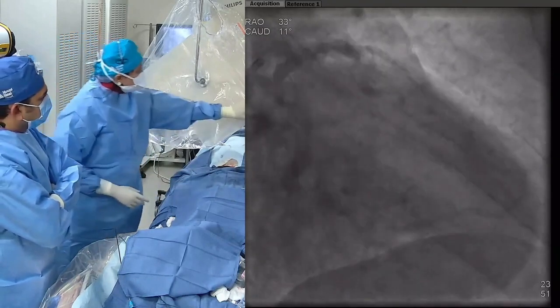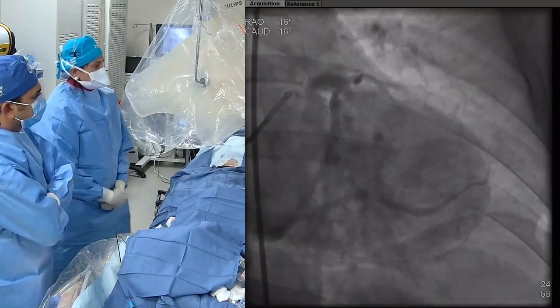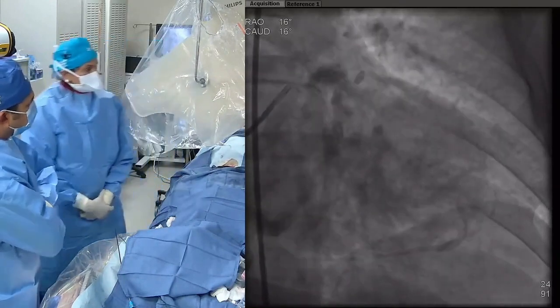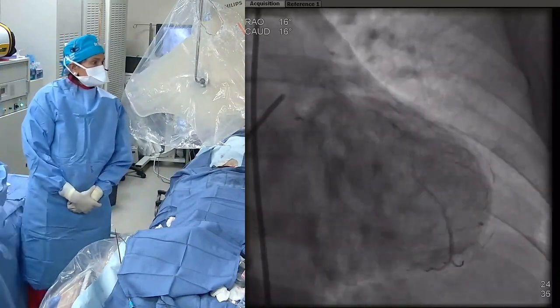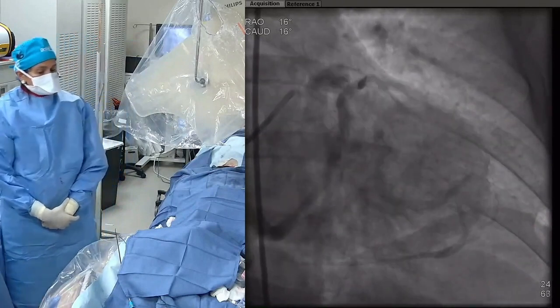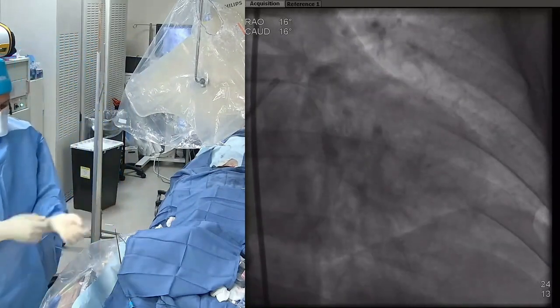Good teaching point. We saw it right after the stent implantation, a little bit of vasoconstriction. I didn't know if it was like you missed it, but here you are with the vasodilators. Really great result. And the final IVUS looks good? Yes. Okay. Excellent. So we are ready in the room. Congratulations.